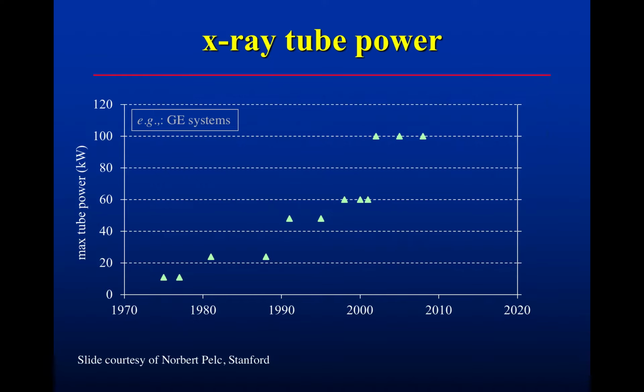And so these are very bright X-ray sources, right? These are specialty X-ray tubes that make huge X-ray flashes, right? And as you can see, up to 2008, and we're going up here with this new generation of tubes, where you're looking at 100 kilowatts, right, of X-ray tubes.